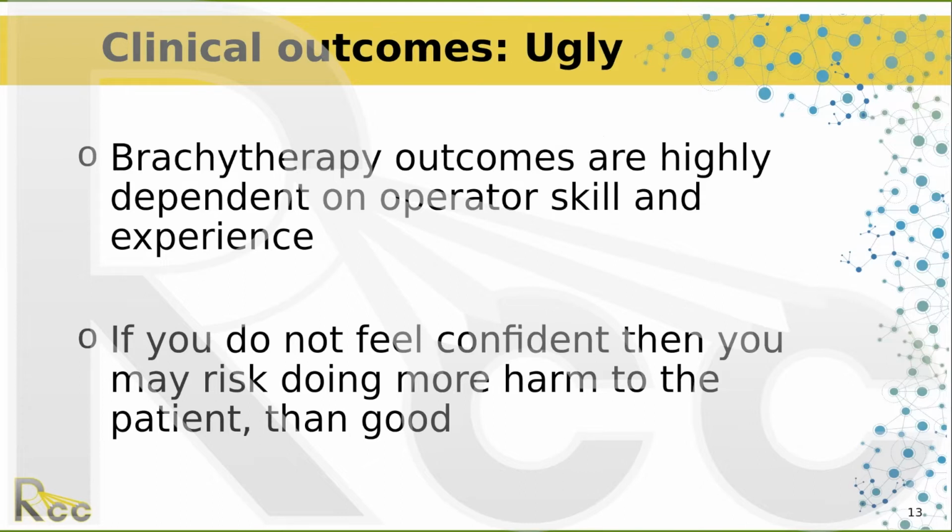Brachytherapy is highly dependent on operator skill. So you want to practice. And if you can practice on a phantom, that's great. But applicator placement is kind of an art form. And there's some people that have the hands for it and some people that don't. So if you don't feel confident, if you're not comfortable, know that it can be dangerous. So it's always a big thing, brachytherapy is kind of an art form, and it's definitely a different treatment modality than external beam, where you have a machine that's delivering this. This is highly dependent on the placement of the applicators in the hands of the physician.